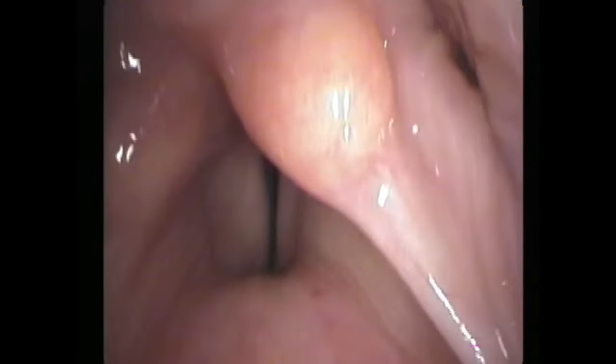But I think the injury is different, and I think there's an injury on both sides. Stopping on this frame of the video, a gut reaction here is to say the left side's paralyzed - you look at it and it looks like the left side's not opening. And she told you she got hoarse, and the left side doesn't open, and you might jump to the conclusion that we need to do something about the left side.